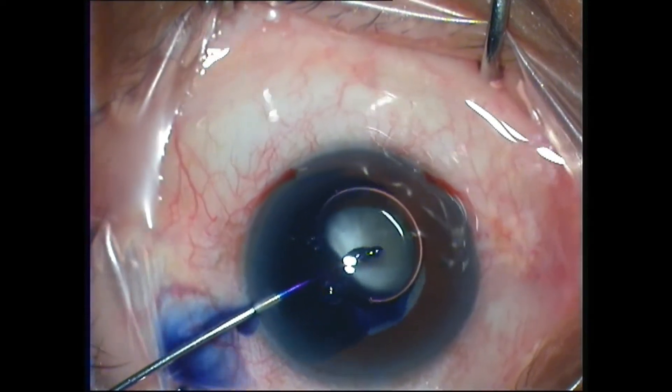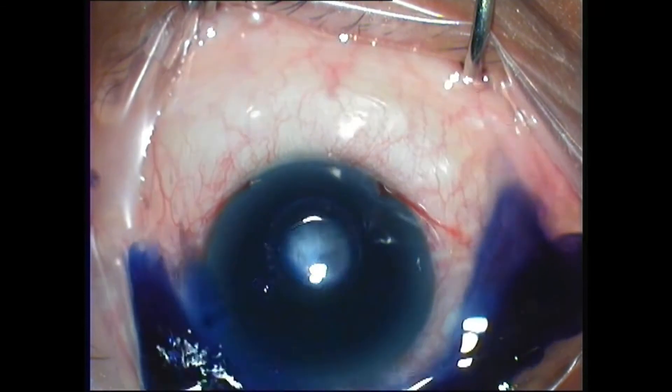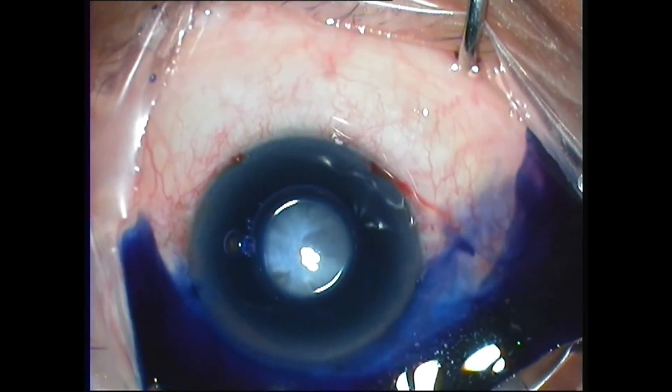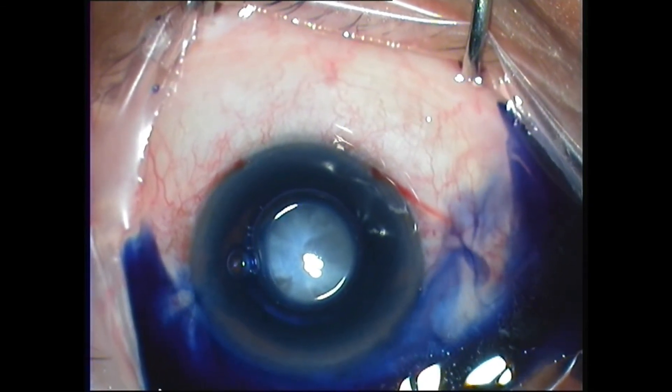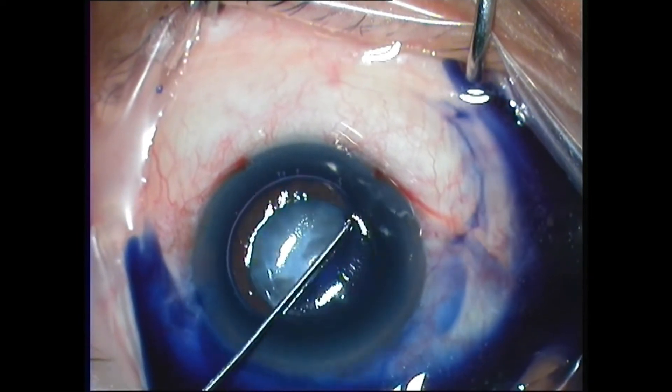In some cases the air trap technique will not work because the anterior chamber is shallow and because there is positive pressure. The air bubble is also large and is contacting the anterior capsule of the lens, which means that there will be a part of the anterior capsule that is devoid of stain.